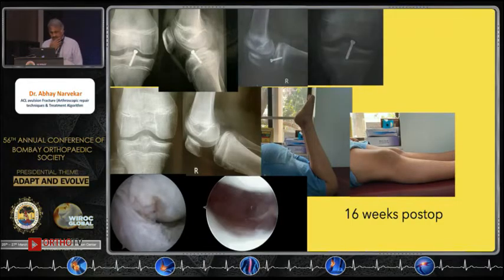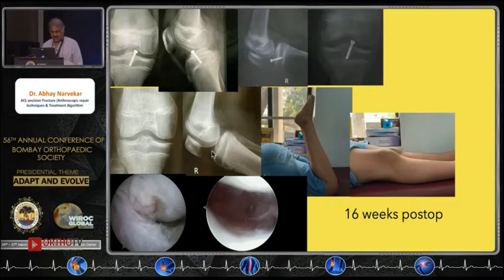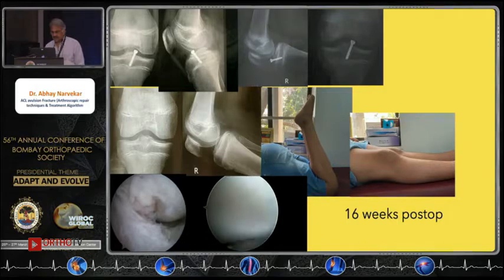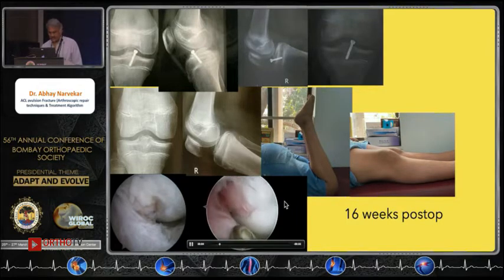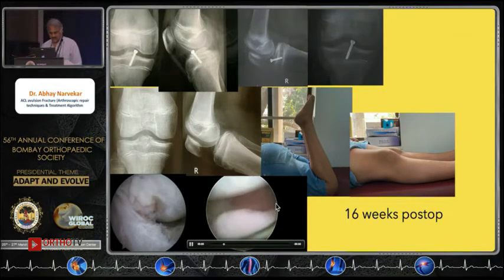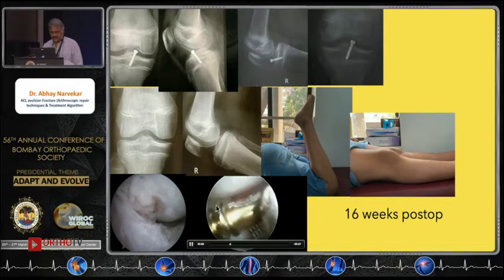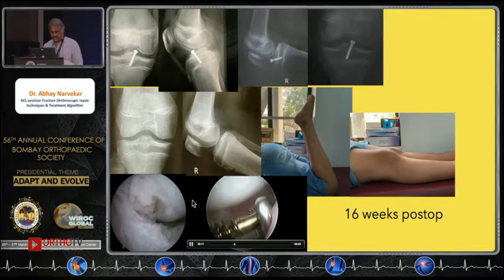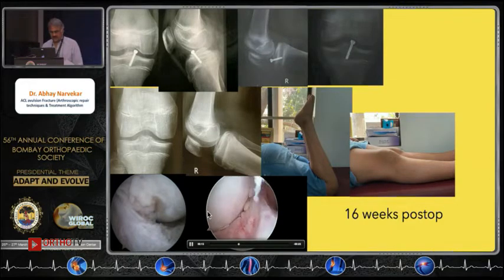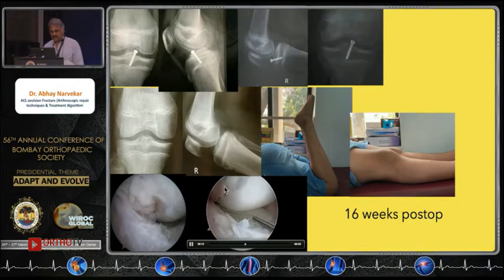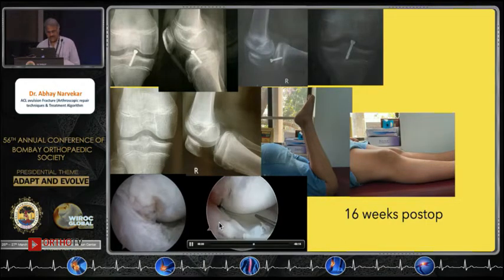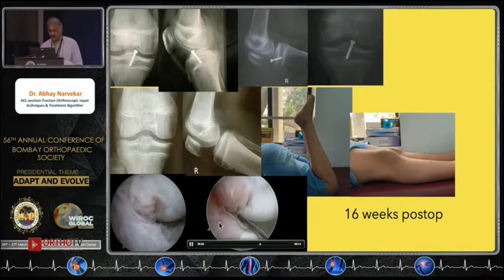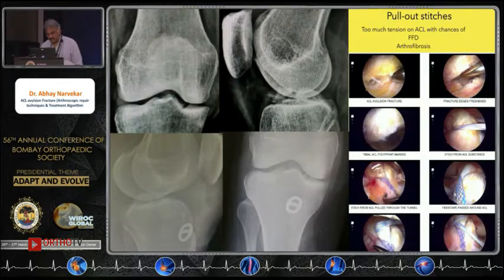This is what was done for this young boy. As you can see, the fracture has healed very well — no flexion deformity, full flexion at 16 weeks. After screw removal, there is no scuffing of cartilage anywhere, no impingement on the intercondylar notch, and the ACL looks pristine — a good outcome for this fixation.